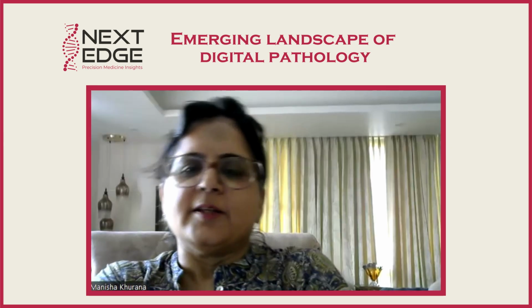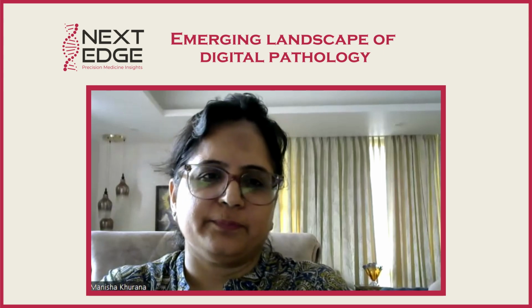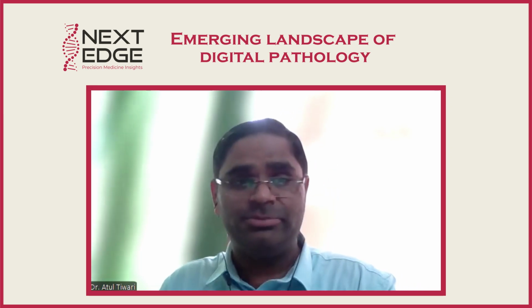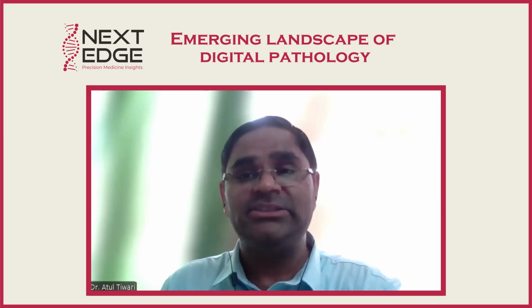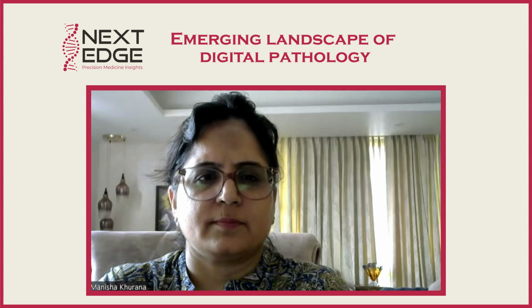Right. So, how does digital pathology improve the workflow in the laboratory? In laboratory workflow, digital pathology helps us in a very good way in that it streamlines slide management. Like I mentioned earlier, slide filing is a tedious task.